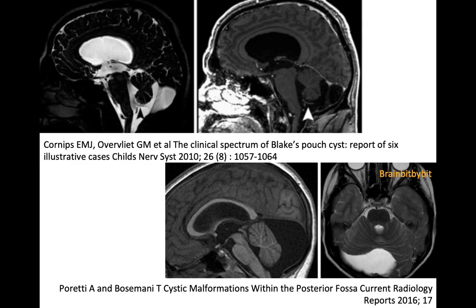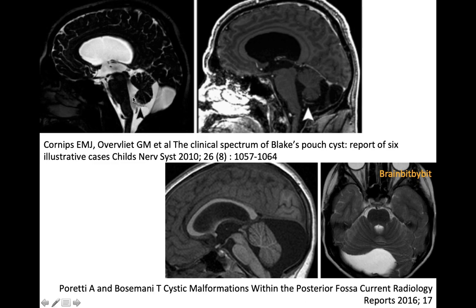Another cyst that can occur in the posterior fossa is an arachnoid cyst, when something goes wrong with the cavitation of the primitive meninges. You can tell the difference between an arachnoid cyst — as seen in this sagittal T1 and transverse T2 image — in that the arachnoid cyst is located posterior to the cerebellum and there is no widening of the foramen of Magendie, whereas in Blake's Pouch Cyst you can see the wide communication between the cyst and the fourth ventricle.